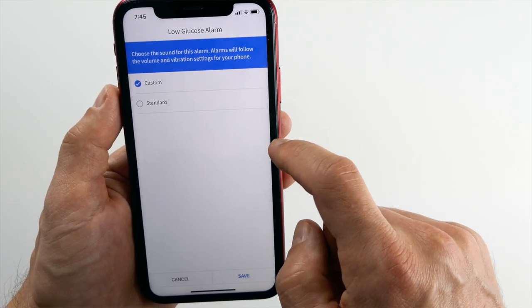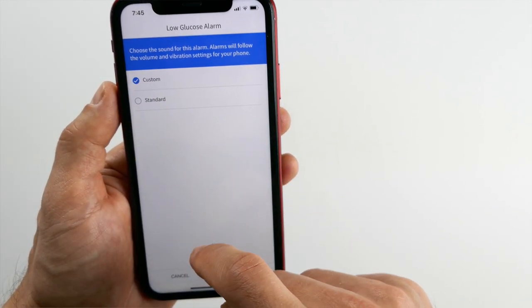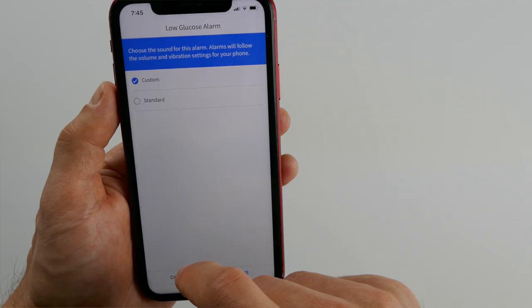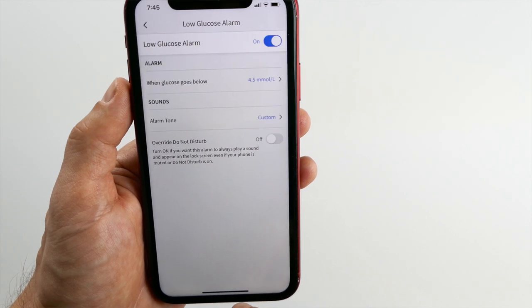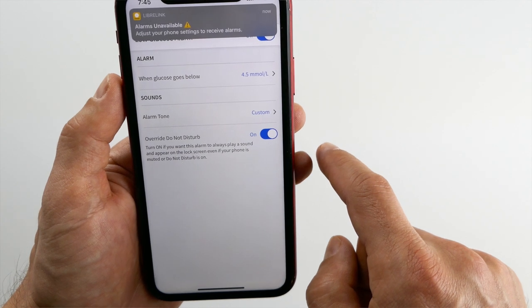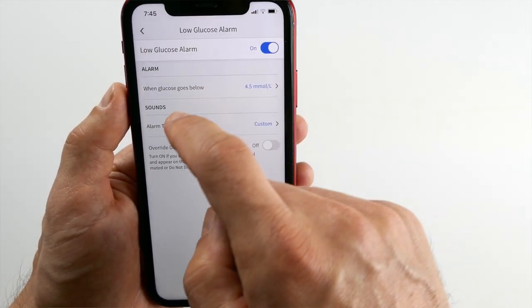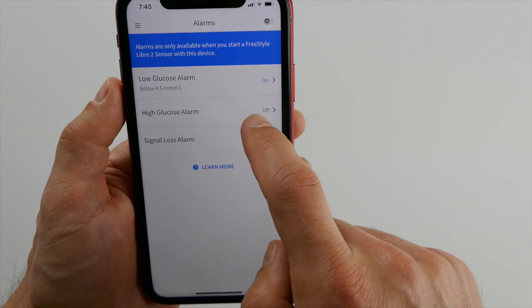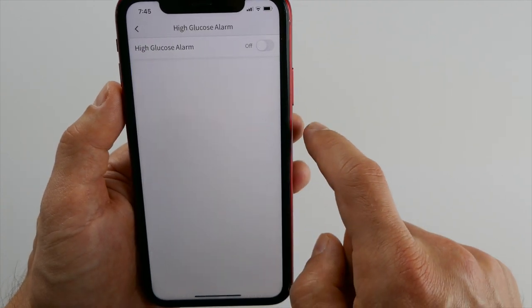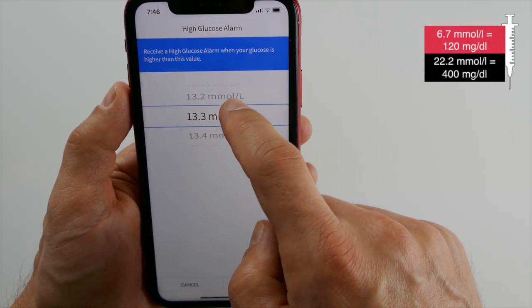You can choose between two alarm sounds: Standard, which is a bit quiet, or Custom, which is quite loud and should easily wake you up even if you have deep sleep. If you want to get alarms on the locked phone screen when your phone is muted or in Do Not Disturb mode, you need to allow this by moving the last toggle to the right and also by allowing all notifications for the LibreLink app in your phone settings. For high glucose alarms the process is exactly the same, and you can set the level for high alarms anywhere between 6.7 and 22 millimole.